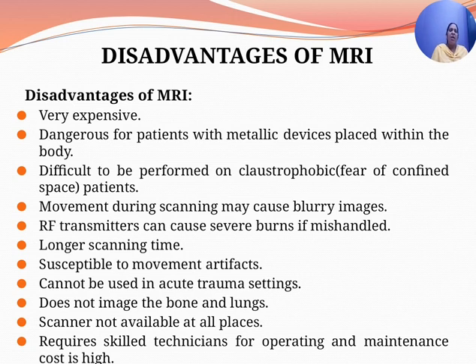The MRI system is a very expensive method of diagnosing and dangerous for patients who have metallic objects placed within their body, and it is difficult to be performed on claustrophobic patients. Movement during scanning may cause blurry images. RF transmitters can cause severe burns if mishandled.